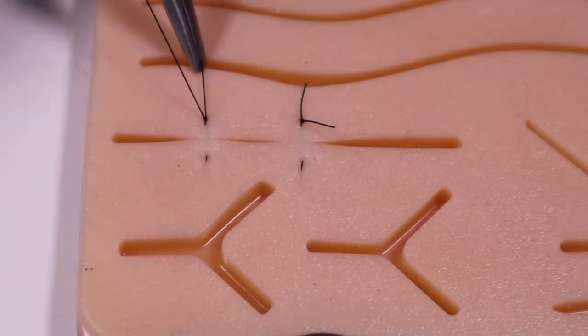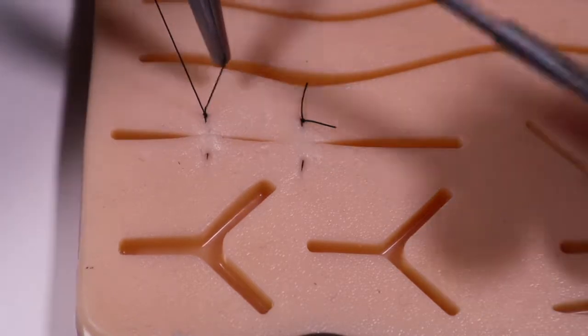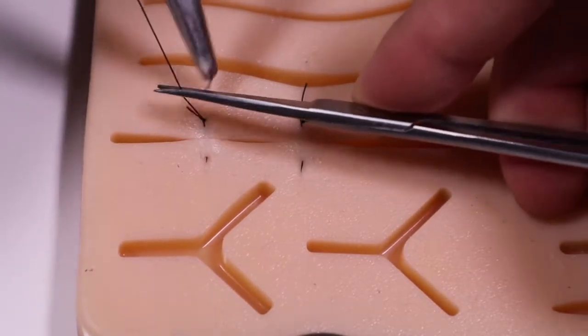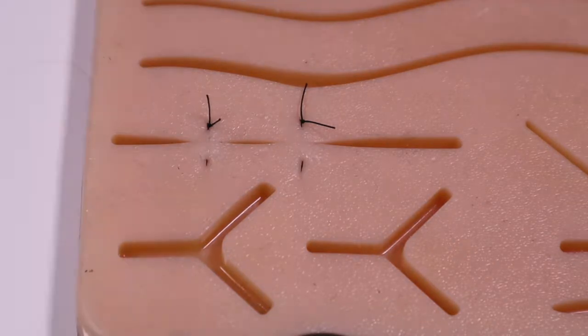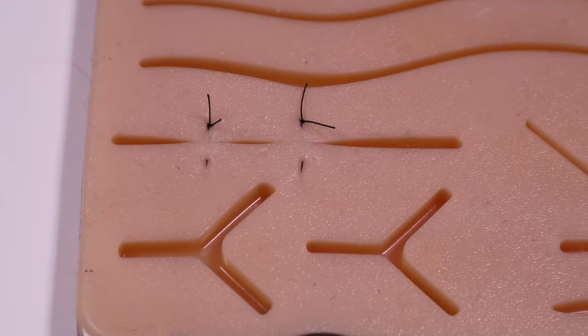And as you can see, this everts the edges of the wound, which as it heals will create a nice aesthetic look.